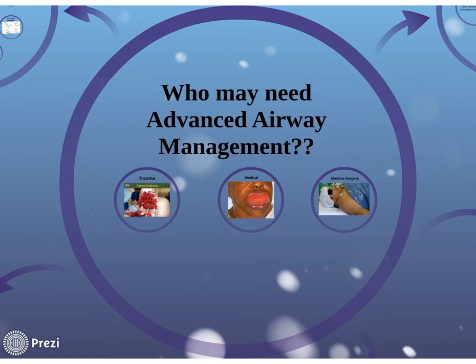What size angiocath? And again, I would use the biggest one I had available. So I wouldn't wait for someone to dig up and find, you know, a 14 if I had a 16 laying right there, right? Whatever I have that's bigger that I can use, I could still save someone's life. But ideally, 3cc syringe, 14 angiocath. And then you need the jet ventilation stuff. So you give these bursts of air just to get them there long enough until someone can do the emergency airway, which is what is that one called? The surgical.